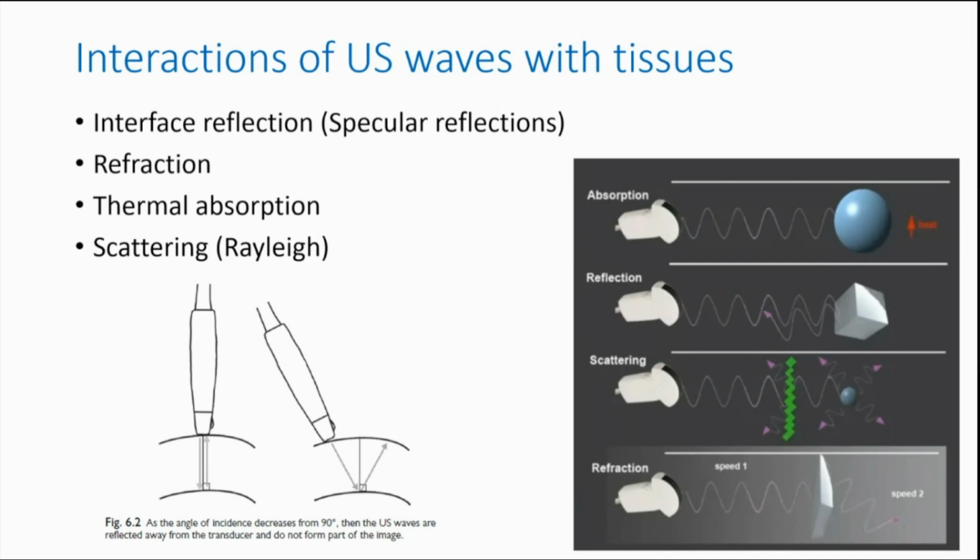And of course, the most important thing is to keep the needle in a relatively flat trajectory. The more acute the angle, the lesser the needle visualization, because of the physics of ultrasound reflection. Of course, this is partially mitigated by the use of so-called block needles, which have good echogenicity, but it will never be as good as an ideal technique where the needle is more or less parallel with the probe.